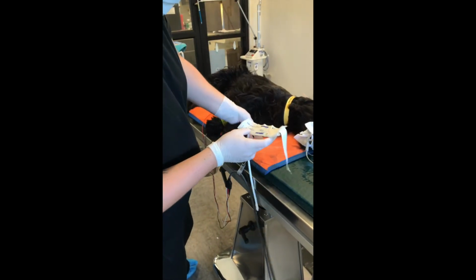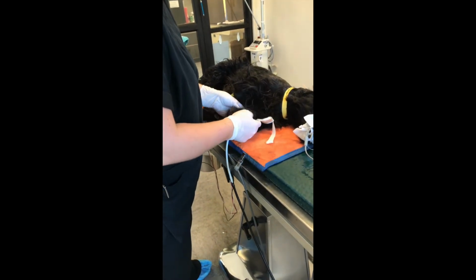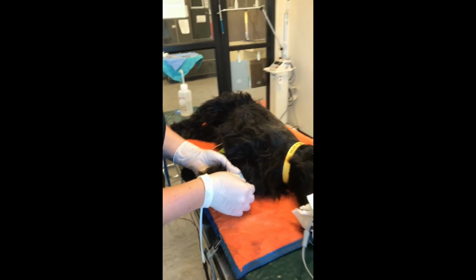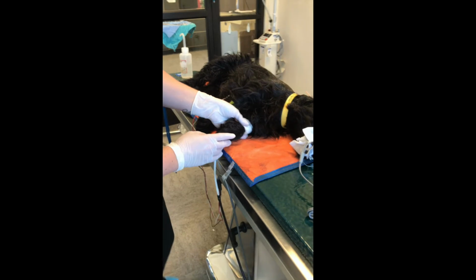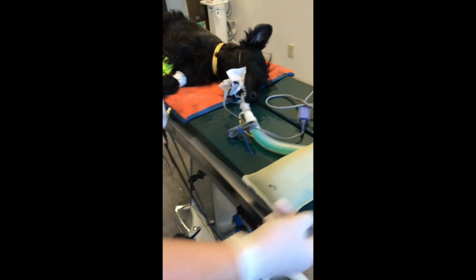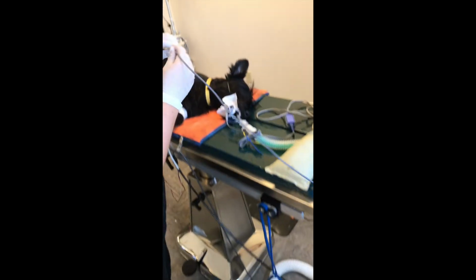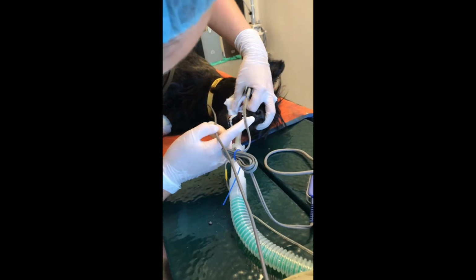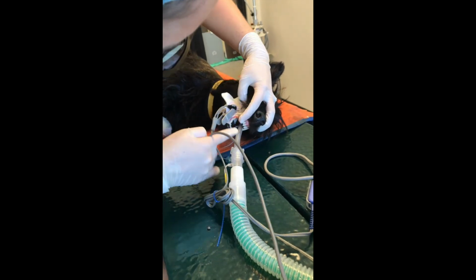And then blood pressure. We've already measured him and he is at a cuff size 3. And then we're gonna do the esophageal thermometer probe.